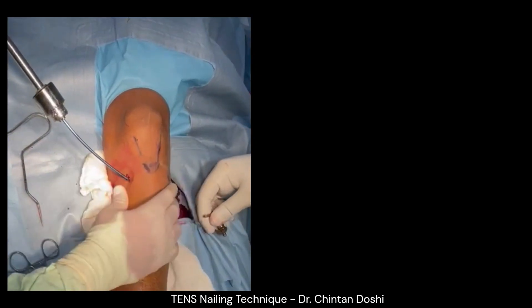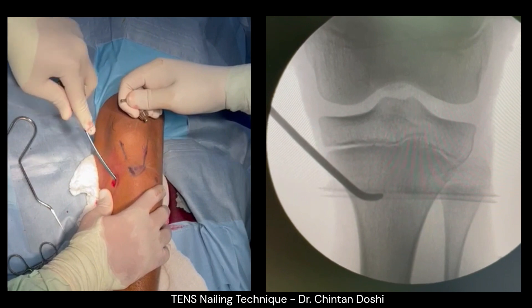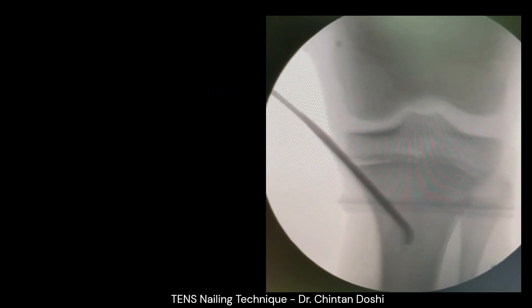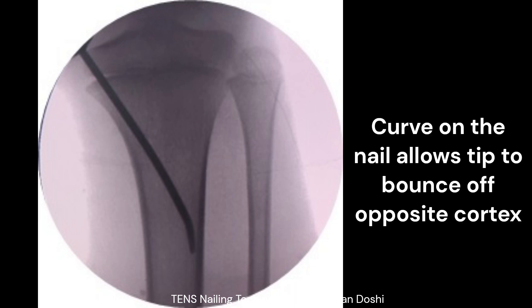The previously prepared titanium elastic nail is entered at the entry point. Initially the nail is entered with the tip facing away from the cortex, and once inside the canal, the tip is turned around to enter the medullary cavity. It is important to turn the nail so the tip does not perforate the opposite cortex. The curve adjacent to the tip allows the nail to bounce off the opposite cortex.